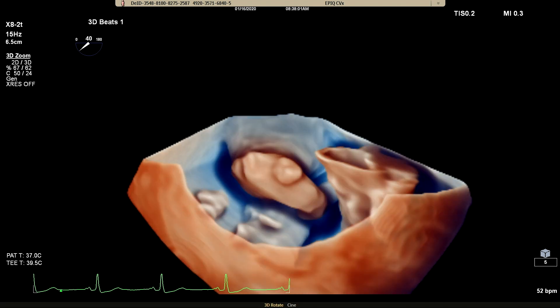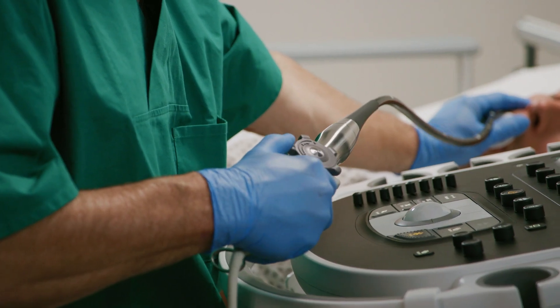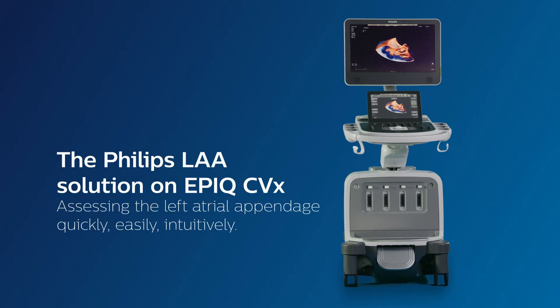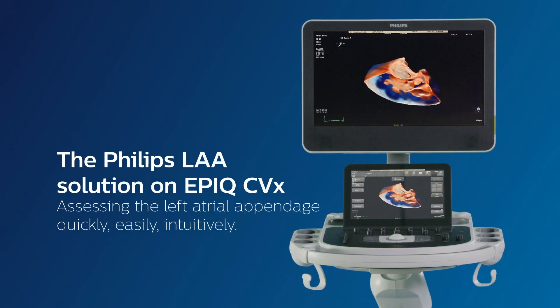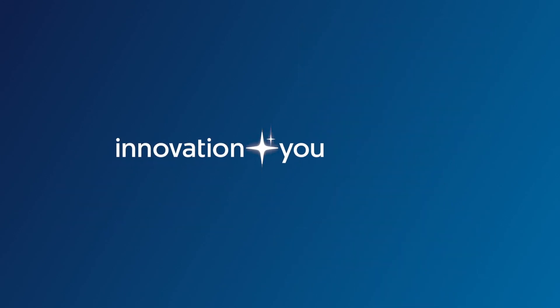Cardiac TrueView makes LAA assessment easy and fast, so you can focus on your patient. Innovation and you. Philips.